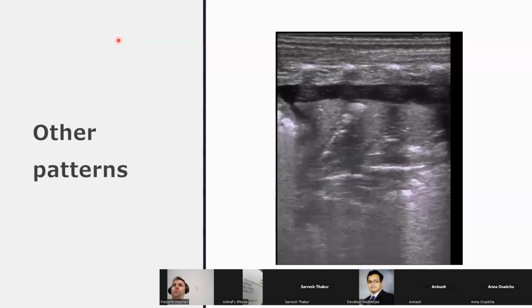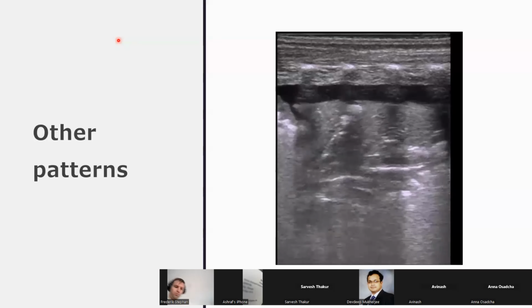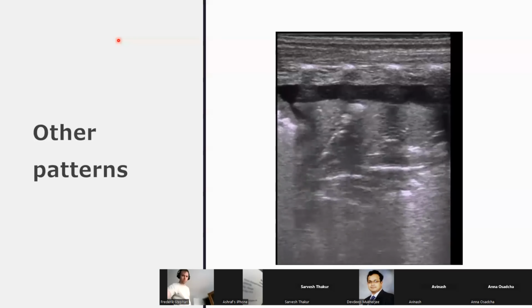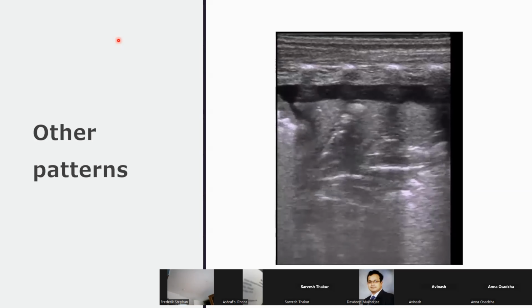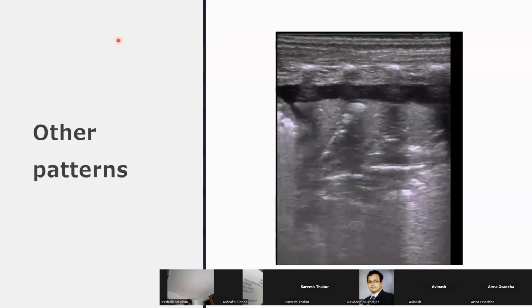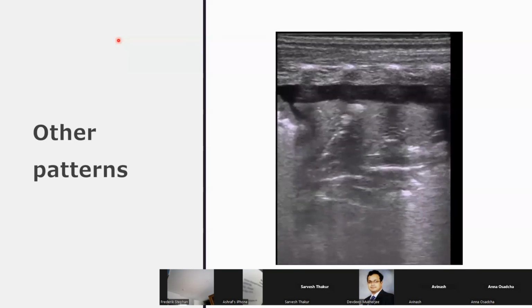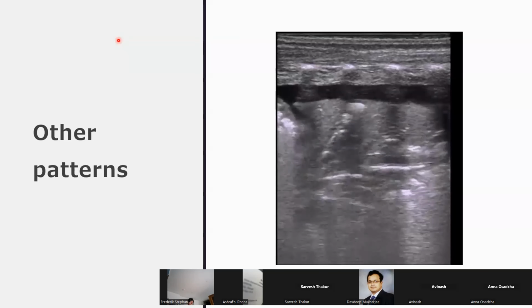And if it is so, then Alok, can you tell me what are the vent parameters at present? So we're 24/6. We're in 80%. Conventional ventilation. Baby's sedated, paralyzed because we're not saturating. We've gone up to 100% now. And how old is this baby? So he's 12 days old. 12 days old. Okay. We've done a CRP. It's about 100. Yeah.